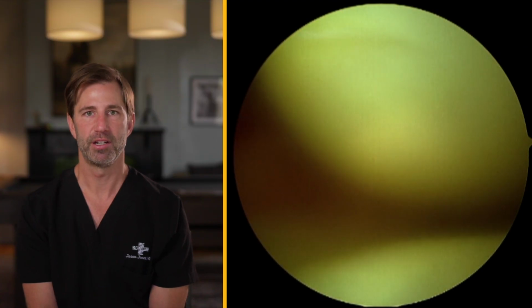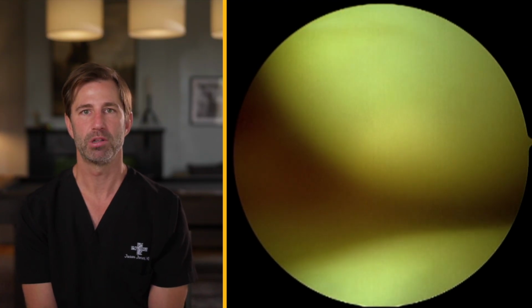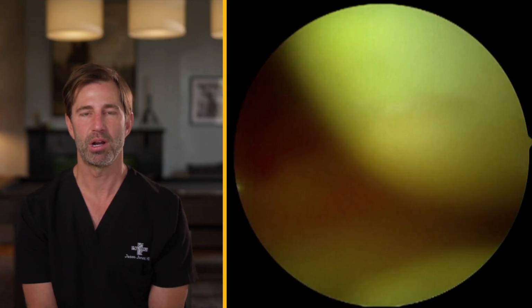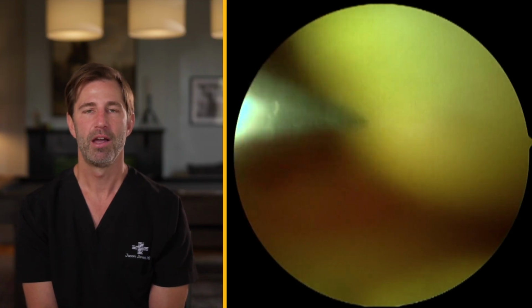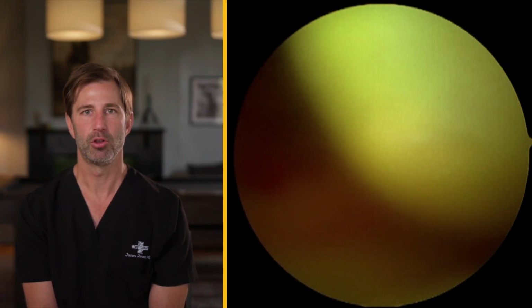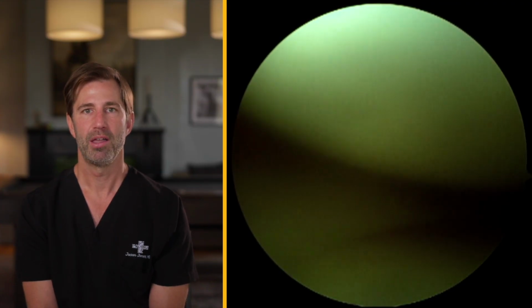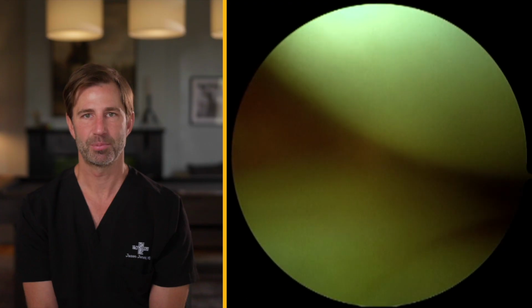Now in this part of the video, we've established what we call medial and lateral portals. That is the initial small incisions that we're able to insert instrumentation through. The first instrument we'll place is a camera. This allows me to view and look for the different injuries throughout the knee. The other instruments that we typically use are what's called a probe. That allows me to grasp structures and check for tears and also loose pieces of tissue or cartilage.